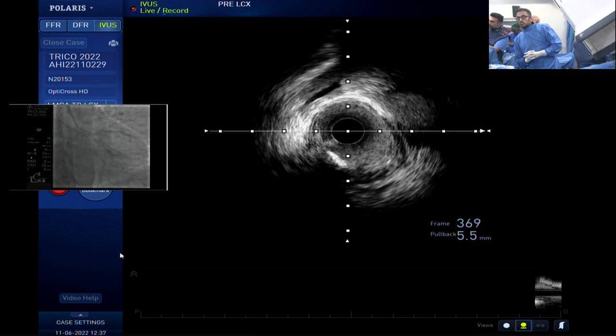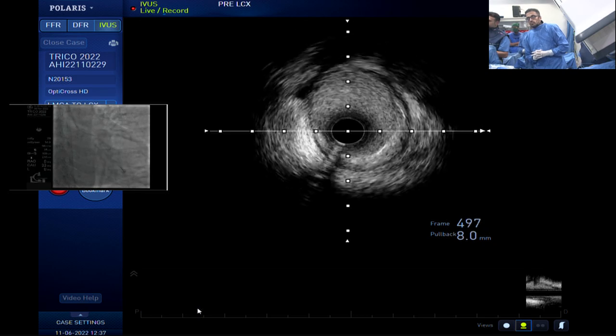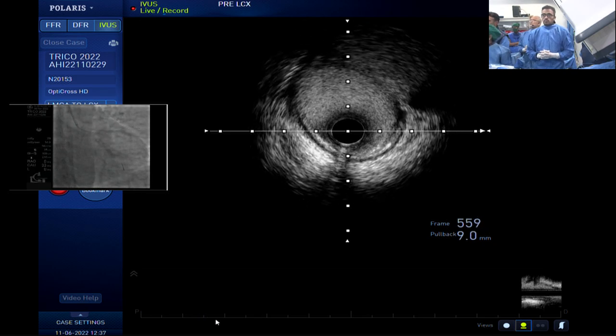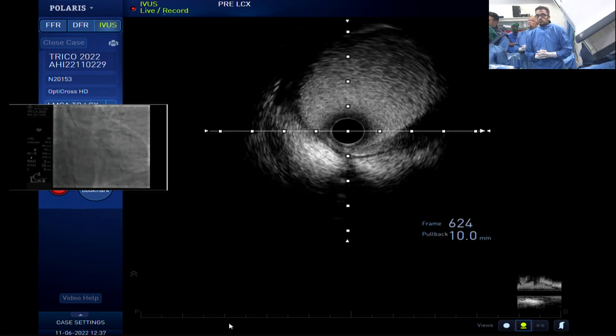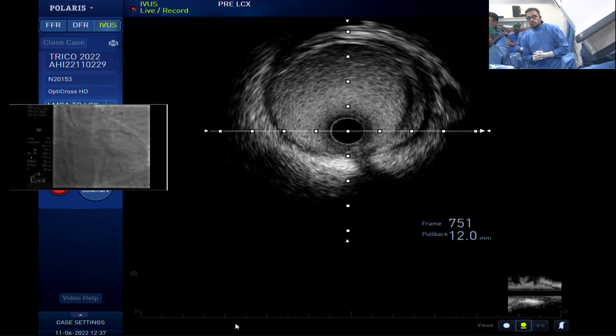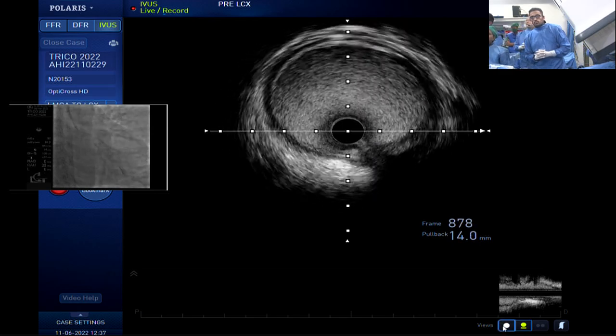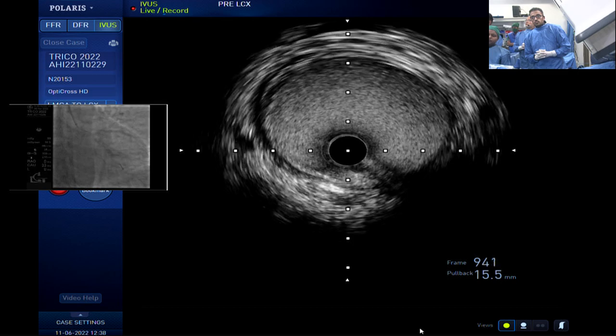You can see there's a little bit of disease on the inferior aspect. It's calcific, but it's not flow limiting. We continue to pull back. There's a little bit of plaque, and look at the ostium. The ostium of the circ is completely normal. This is coming back into the left main. You see at about 3 o'clock there's a little bit of plaque, but the left main is largely undiseased.